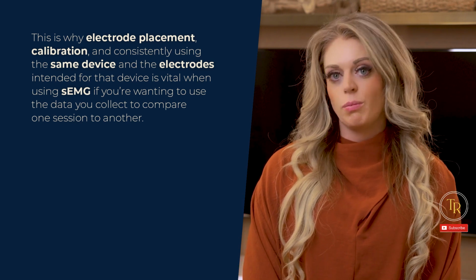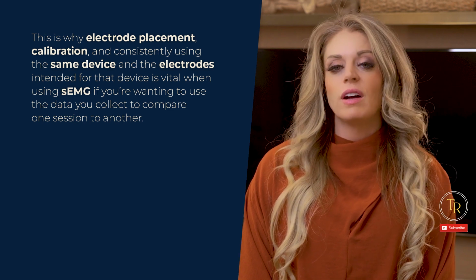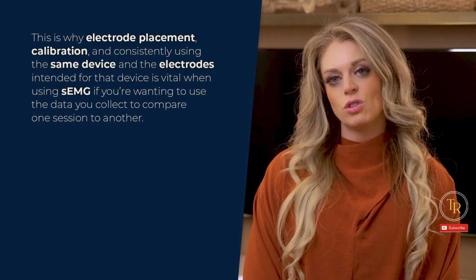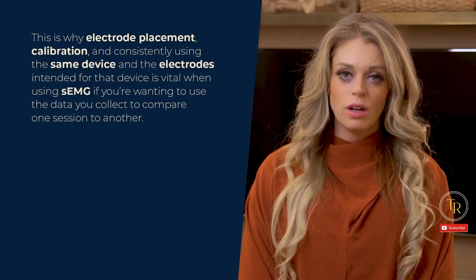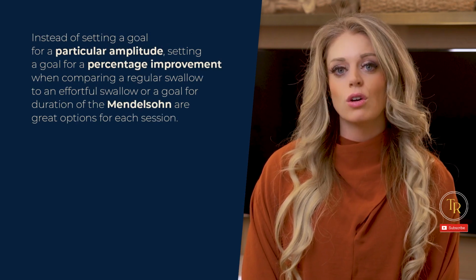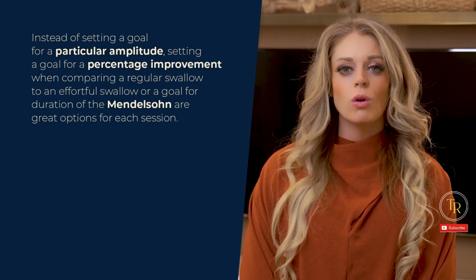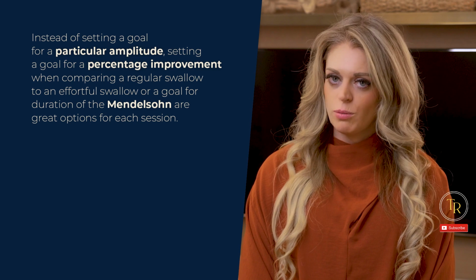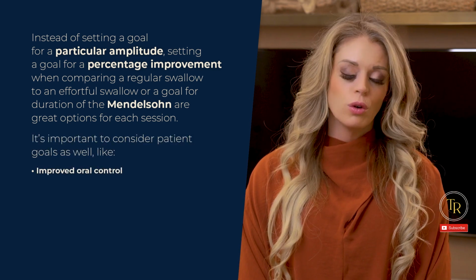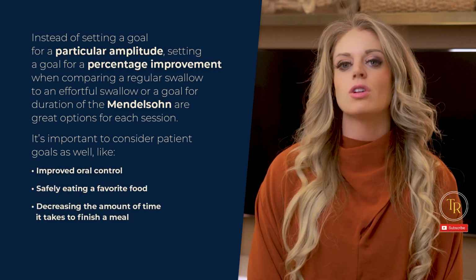There are multiple factors at play, and they're all a little different for each patient. Just like everything else, when it comes to providing the best care, we have to look at the bigger picture and move away from any one-size-fits-all approaches to evaluation and treatment of these incredibly complex patients. Instead of setting a goal for particular amplitude, setting a goal for a percentage improvement when comparing a regular swallow to an effortful swallow, or a goal for duration of the Mendelsohn are great options for each session. It's important to consider patient goals as well, like improved oral control, safely eating a favorite food, or decreasing the amount of time it takes to finish a meal.